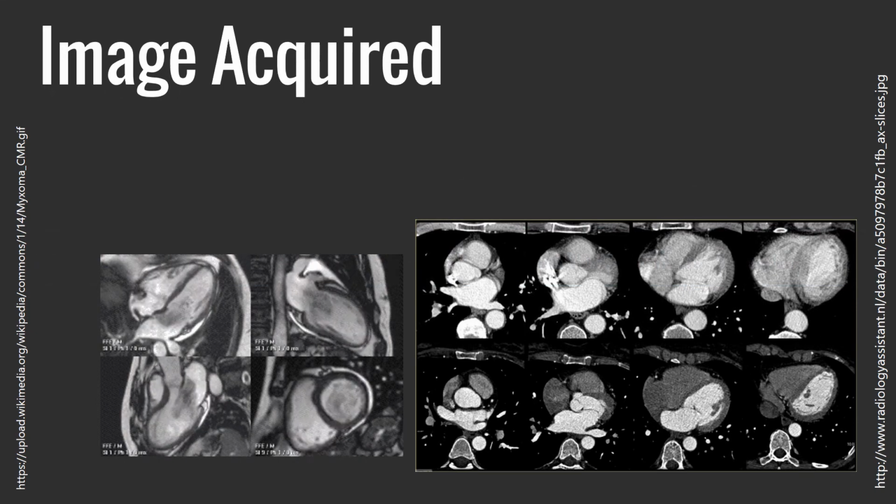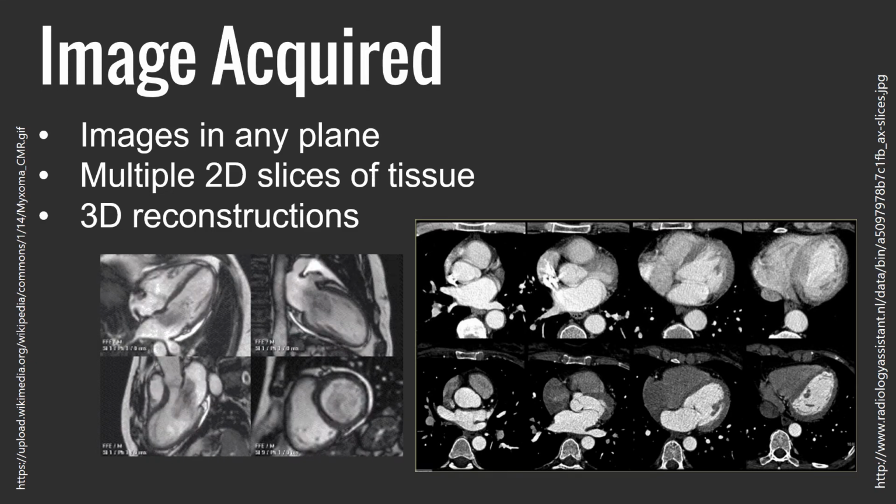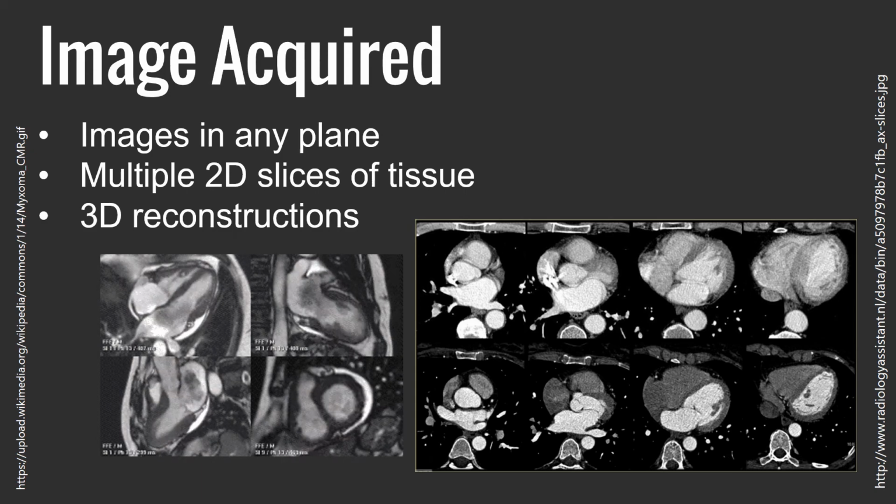So, in the past, CT was limited to acquiring images in the axial plane only, but now both can acquire images in any plane and can generate multiple 2D cross-sections and 3D reconstructions.